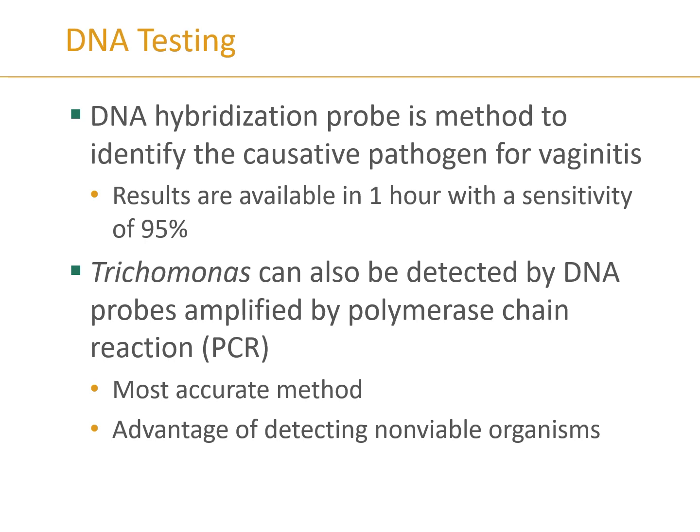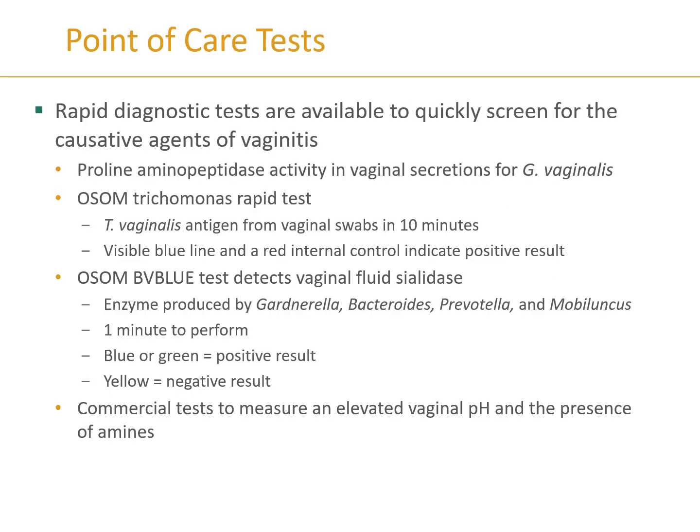So some of these things will now be checked for using PCR testing or some sort of DNA hybridization probes. Some of the old methods of doing wet mounts and gram stains and setting up cultures are being replaced with kit tests or your DNA tests, your PCR tests, to give you a more rapid diagnosis. There are a few point-of-care tests or rapid kit tests out there and available.